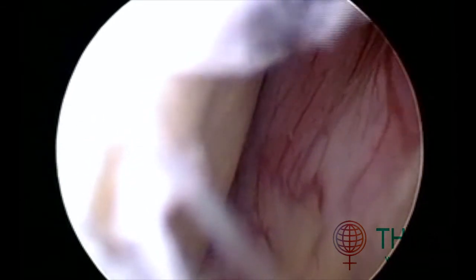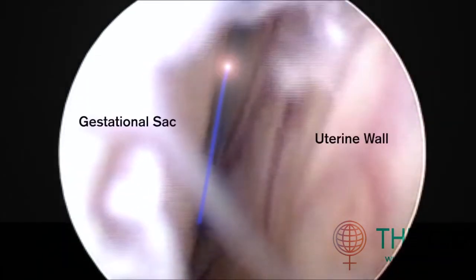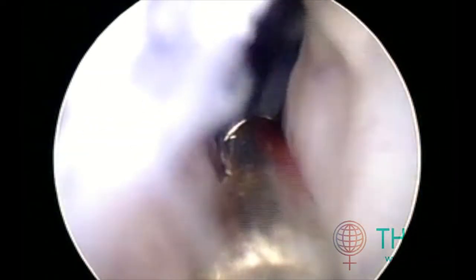The hysteroscope is advanced slowly with minimal infusion of distension media to avoid disrupting the gestational sac. The IUD is located, and again, using the hysteroscopic grasper, the IUD is grasped firmly and slowly removed. We attempt to keep it in view as the hysteroscope is removed from the uterine cavity and endocervical canal.